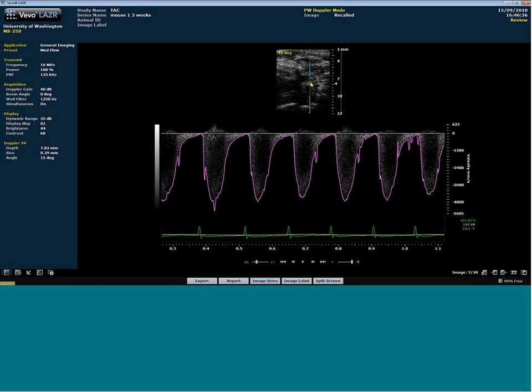So if you physically position the suture here, this is a really good position because the downstream side of the suture is right here, which is right in the middle of the area to measure. Then we're well away from the blockout zones. We can place the sample volume gate right here in the middle and get the best measurement. So those are sort of all the range of things that I would say you need to look at to adjust.